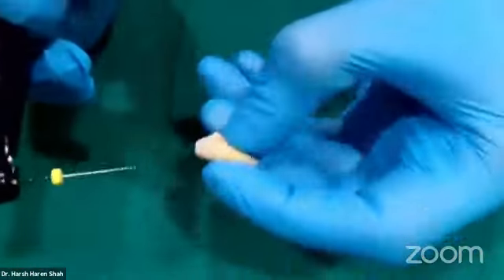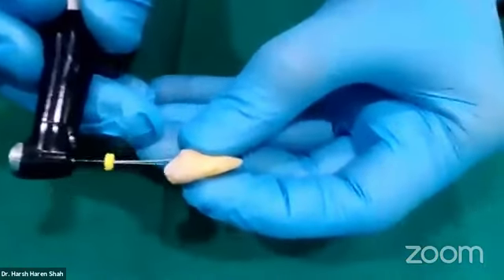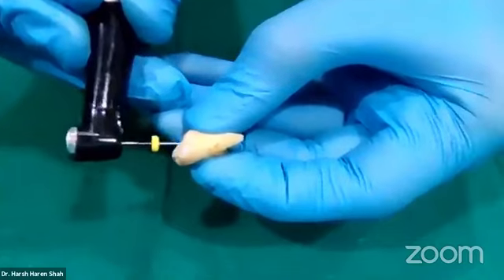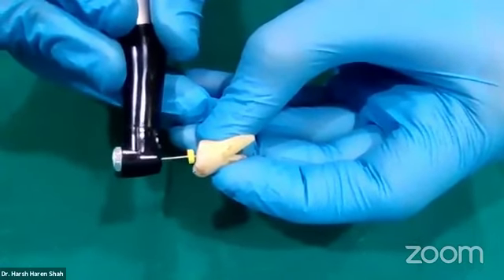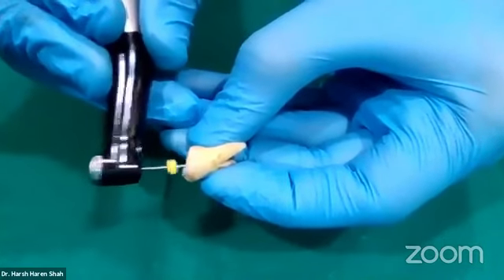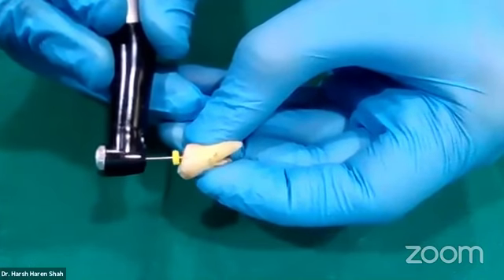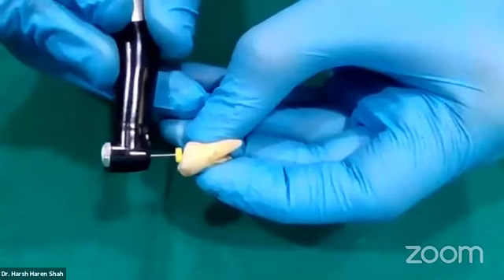I will be taking this tooth. I don't need to do anything. I just activate my file. It is in pure rotation right now. It is not reciprocating. I will go gradually to the complete working length. I will not push the file at any stage. I'm going very slowly. If I feel any resistance, I pull it out. And yes, now you can see I'm reaching the complete working length.